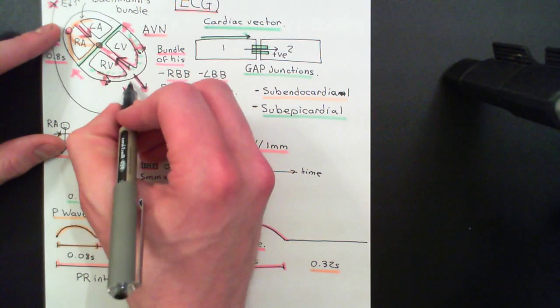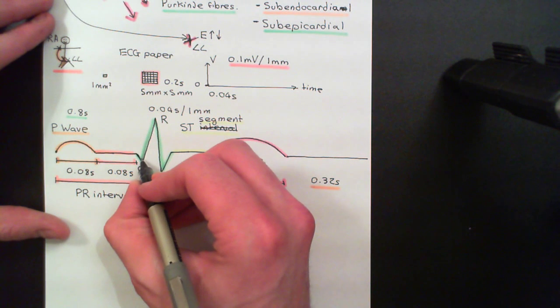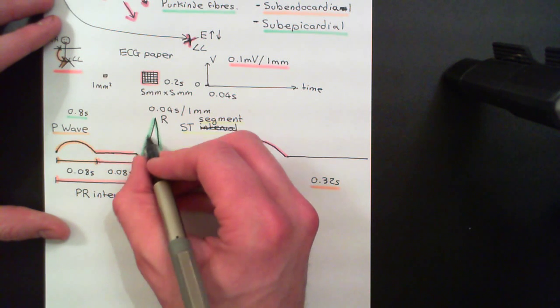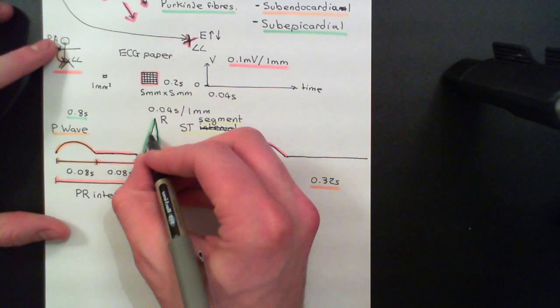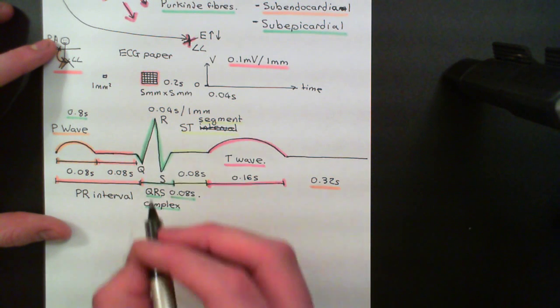So we're now going to get a massive deflection upwards, just like in the P wave, and this is what the R wave is here. Part of this upward portion here will be the reversal of the Q wave, but mainly it's dominated by the R wave upstroke here, as the current is moving down in the direction towards the left leg, and we're getting this rise in the electrical potential down at the left leg and drop in the electrical potential up at the right arm, and that's what's causing this sudden electrical potential difference between the 2 points.